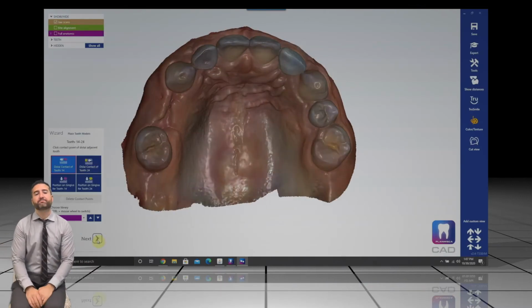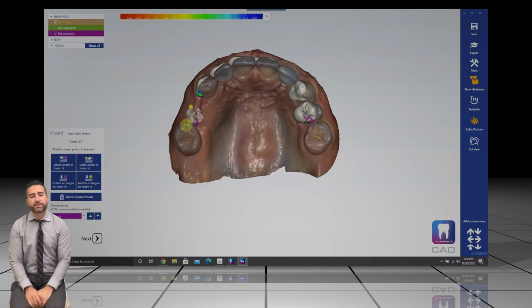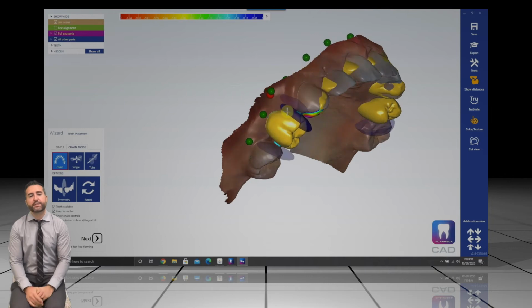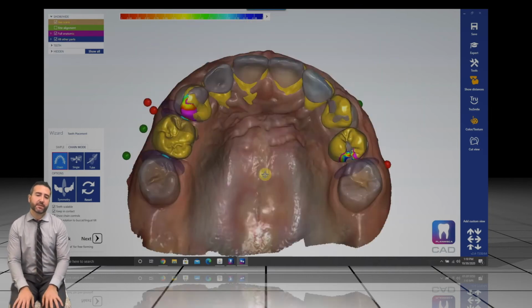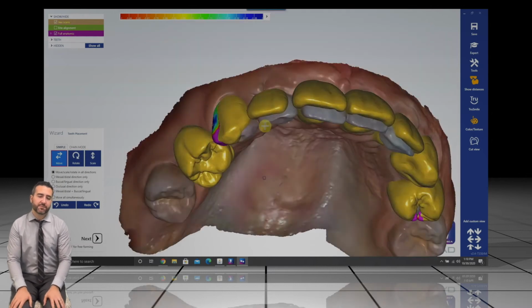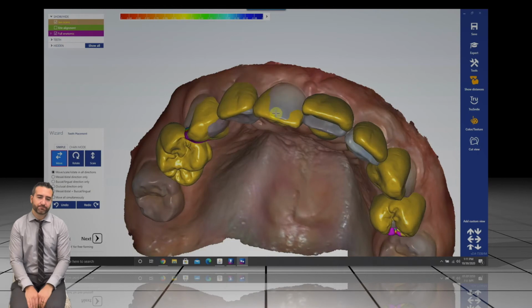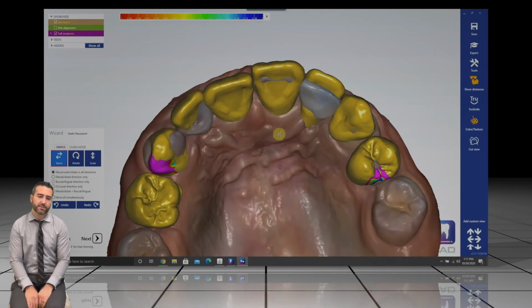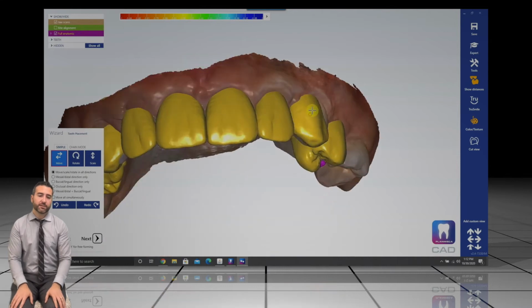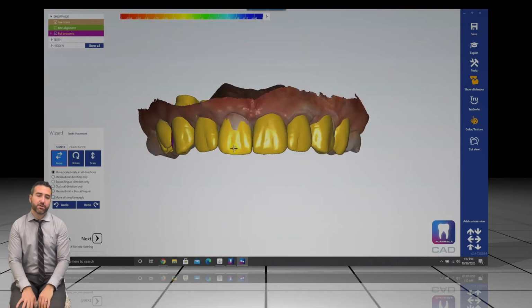So here's a patient. This is the patient that we scanned earlier. Now we're just bringing him in and we're going to do a little wax up because they're interested in some implants. They're interested in maybe getting those anteriors redone. They're not super happy with their smile. And so here we are in PlanCAD Premium. Waxing this patient up in this software is really easy and fast. It's almost like setting a denture. You basically can move teeth individually or all as one unit in a chain mode.